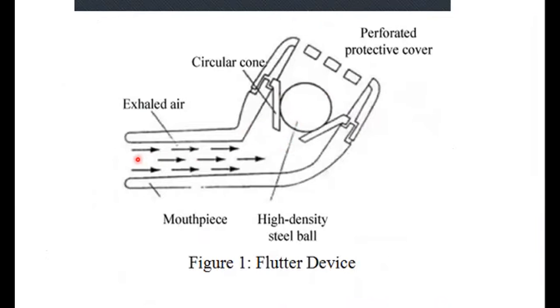Right here, and as you blow into it, the ball rises and falls, and this trap opens and closes, and that puts back pressure in your lungs, like a fluttering back into your lungs.